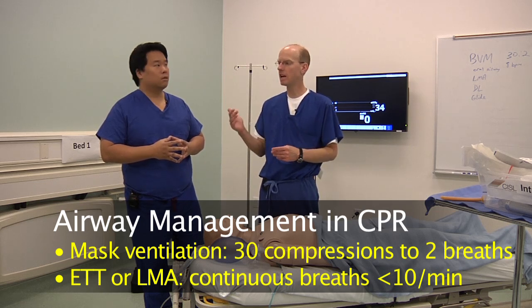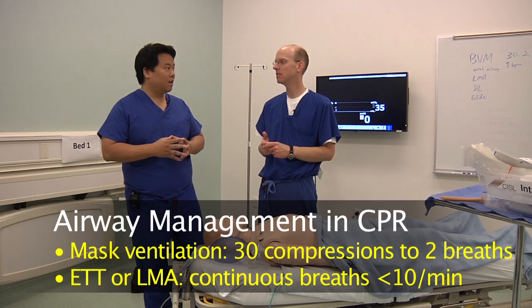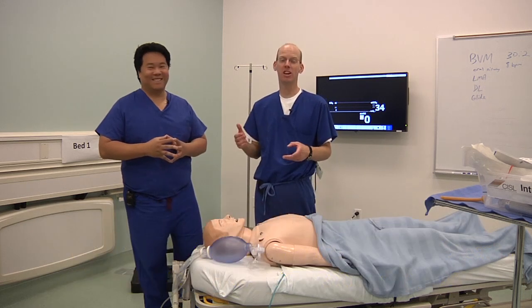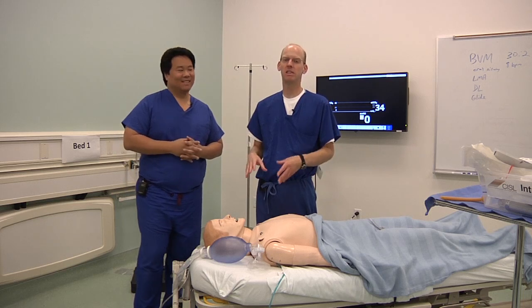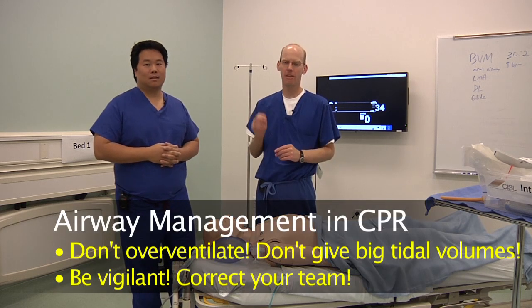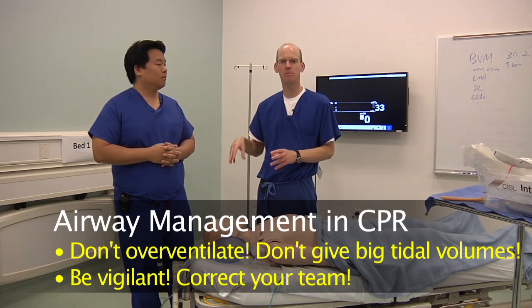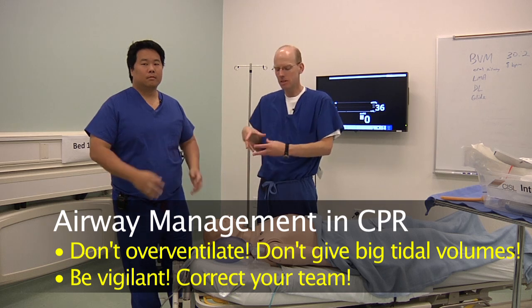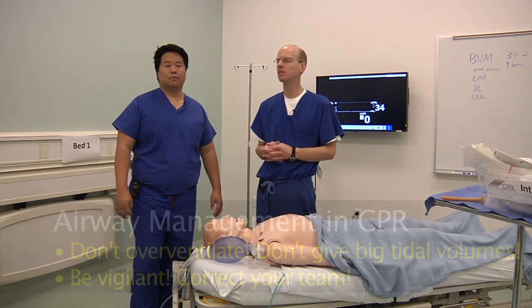Do you know what the actual average ventilation rate is during an arrest? Higher than that, I assure you. It's about 30. Do you know why it's 30? You can't squeeze an Ambu bag any faster. Trust me, this is something that's going to happen. People are going to overventilate. You have to watch for it. You have to correct your team. And you've got to make sure they don't give big tidal breaths, because you may get them slowed down, but then they're going to just give these big tidal breaths. It's little puffs just to get some oxygen into the patient.